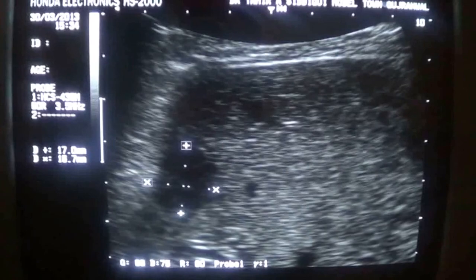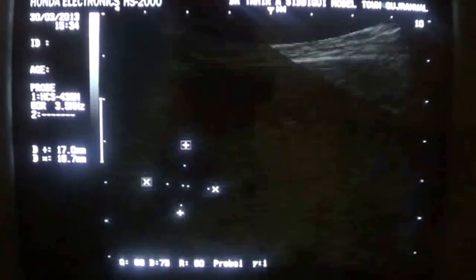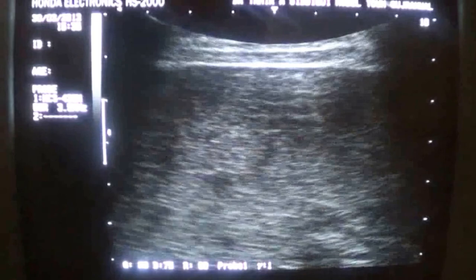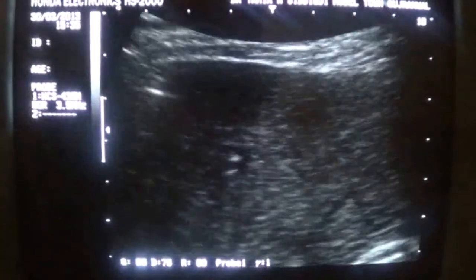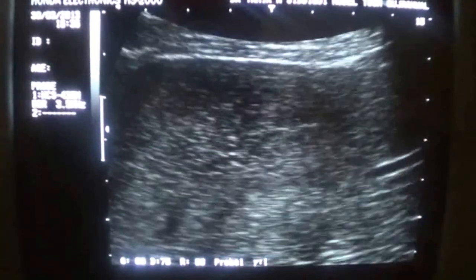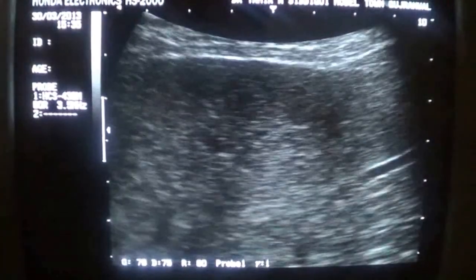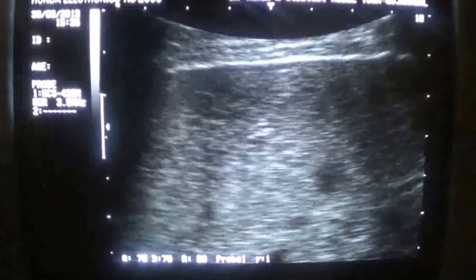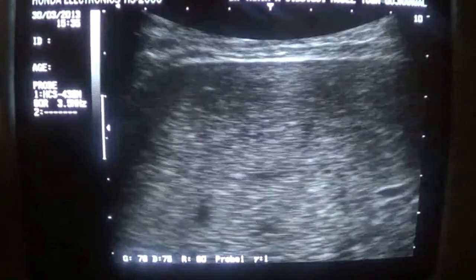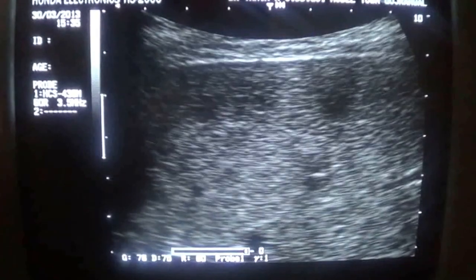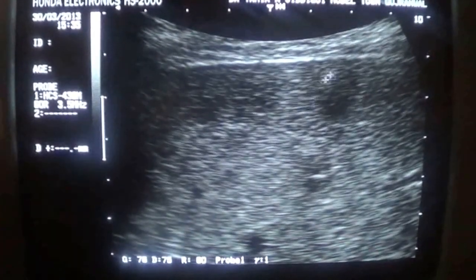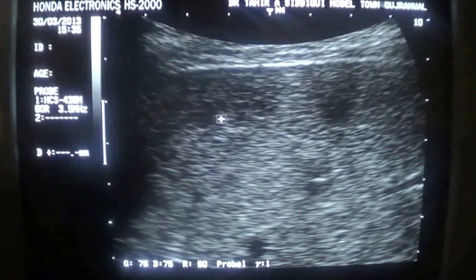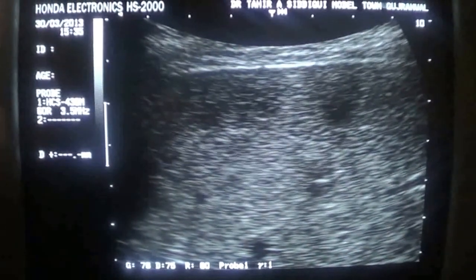This is a magnified view and we will see many others as well — not only this one. Here we are coming across another one. These are small-sized lesions.